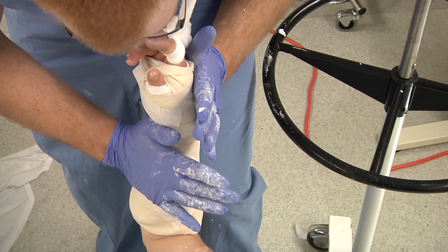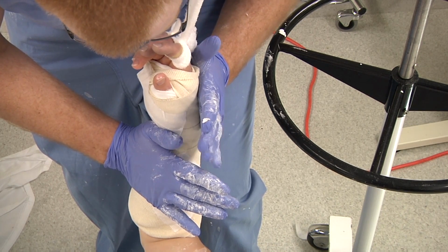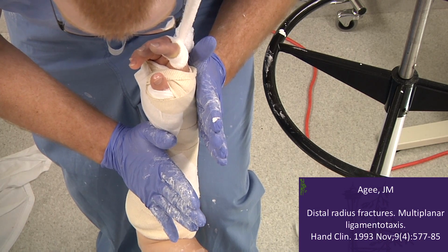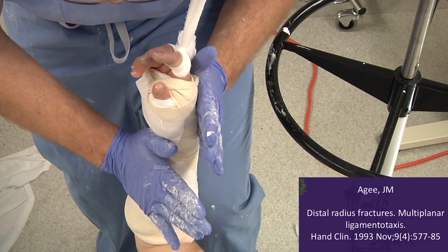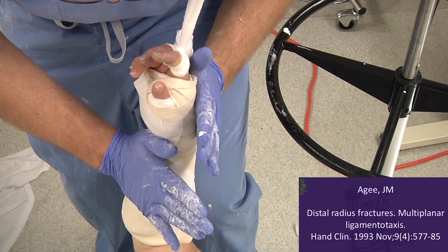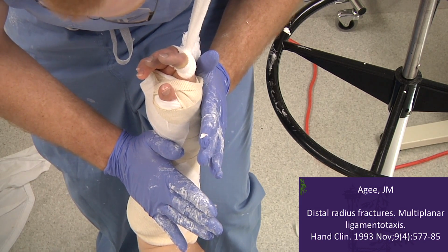Good paper by AG on that. The link we can put at the bottom or attached to the screen. At this point, it's very important to maintain your reduction and your reduction maneuver until the plaster is hard. If you release too early or take your traction off, then you can lose your reduction.